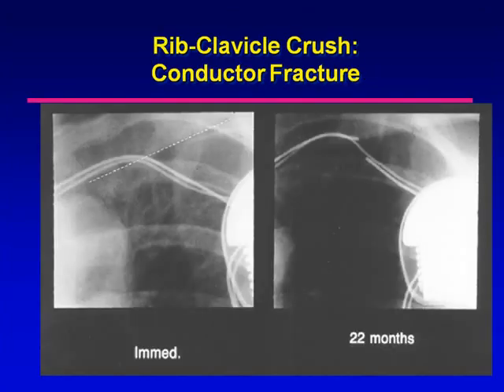Subclavian approach, and it just shows some pictures. Subclavian approach to implants is the most favored, or the most used. The cephalic approach does not result in subclavian crush, but it is a different skill and takes a little bit more time. The so-called extrathoracic technique is becoming more popular now because of the worries about subclavian crush. The problem is that there's a lot of very tough material between the clavicle and the first rib.